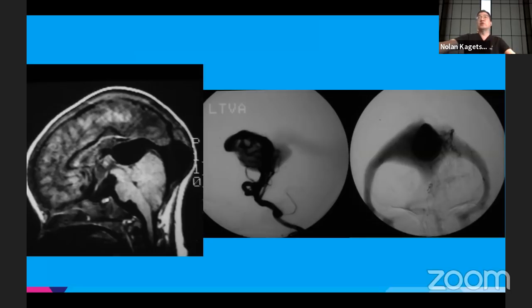So there's two places that a pediatrician will listen to. One is the head, and I don't know how much you've been shadowing other folks, but what other area do they listen to? There's two places. The other place is actually the liver. So there's two places where neonates can actually have a fistula. One is the vein of Galen malformation, and the other is hemangiomas that cause a short circuit of the blood in the liver. But I'm a neuroradiologist, so I'm going to show you the brain.